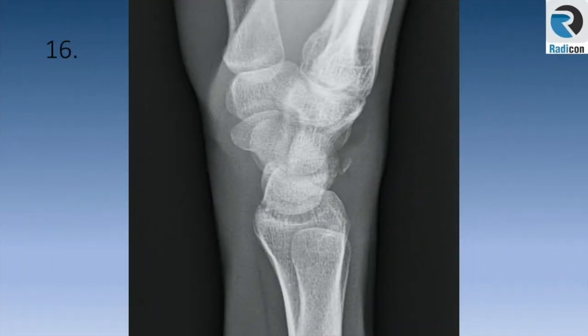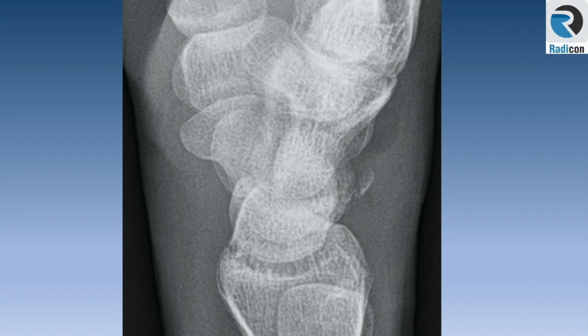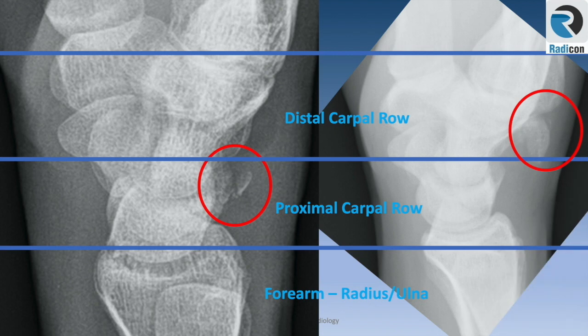Case 16 is a lateral wrist view. Let's zoom it up. There is a small avulsion fragment at the dorsal aspect of the carpal bones, in keeping with an avulsion fragment from the dorsal aspect of the triquetral bone. This is the classic location of a triquetral avulsion fragment. If a similar fragment is seen a little more distally near the carpometacarpal joint, it could signify a hamate avulsion or metacarpal base fracture.